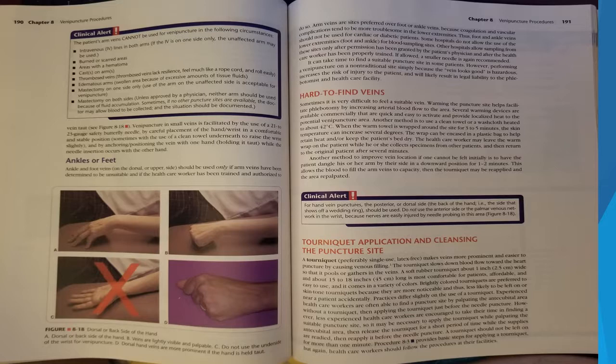Clinical alert. For hand vein punctures, the posterior or dorsal side, the back of the hand, the side that shows off a wedding ring, should be used. Do not use the anterior side or the palmar venous network in the wrist because nerves are easily injured by needle probing this area.